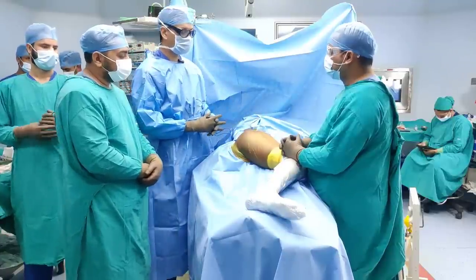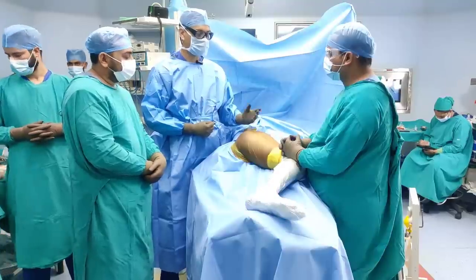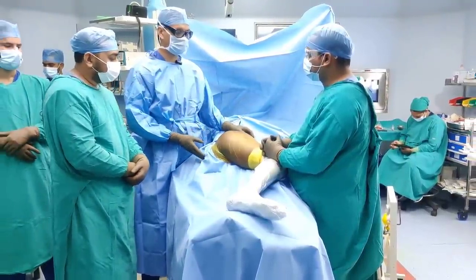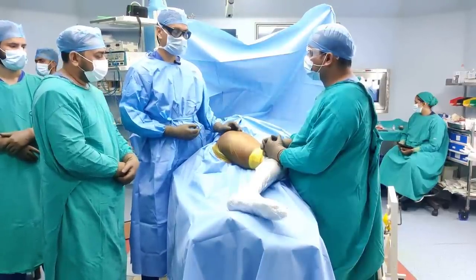The position for this surgery is like your position for a hip replacement or hemi arthroplasty. The patient is on the lateral position, we have got the side support, and I will be standing on the side I am operating. My next step will be to show you the skin incision.